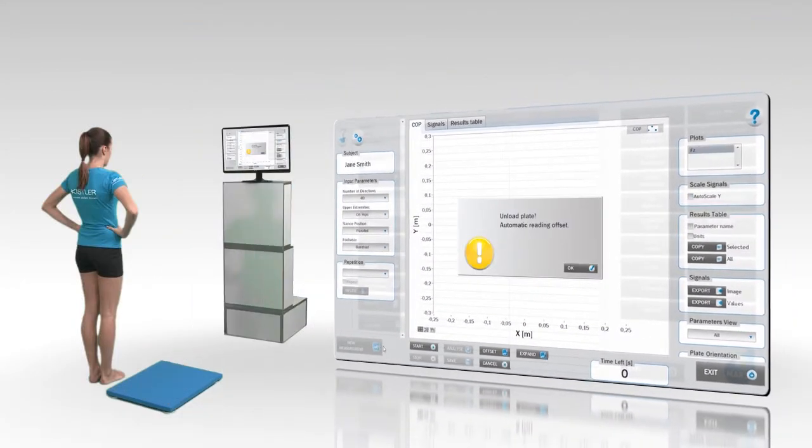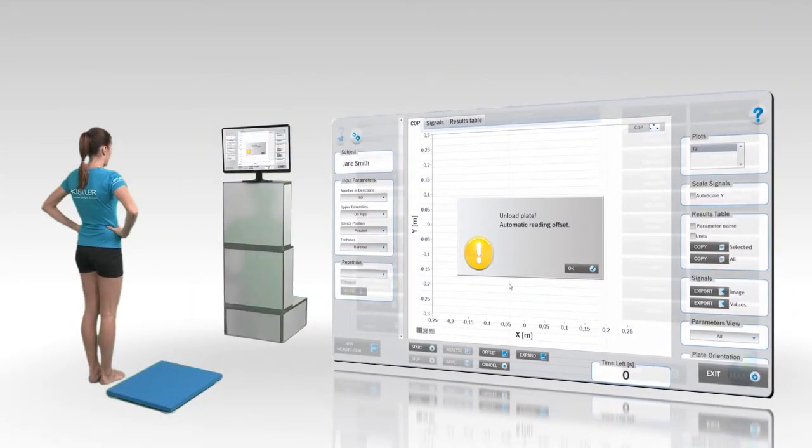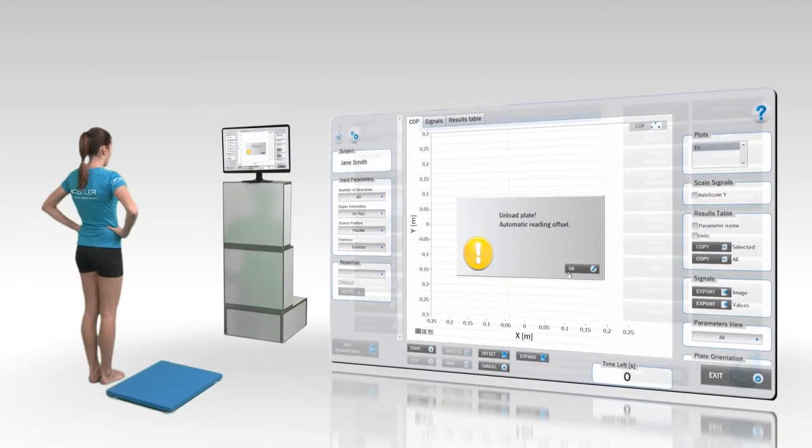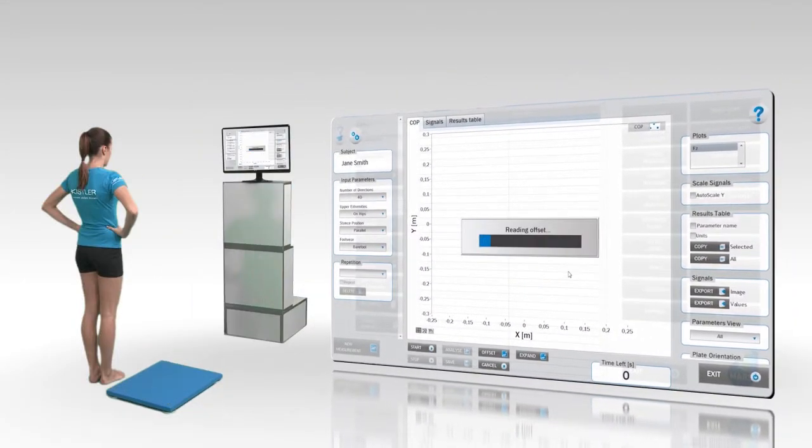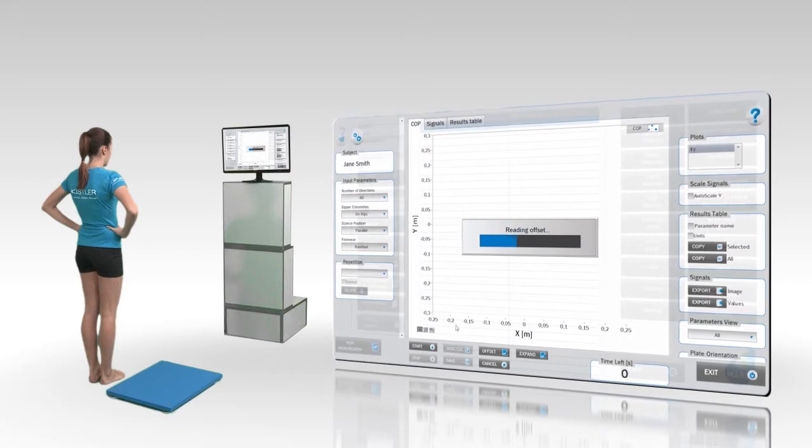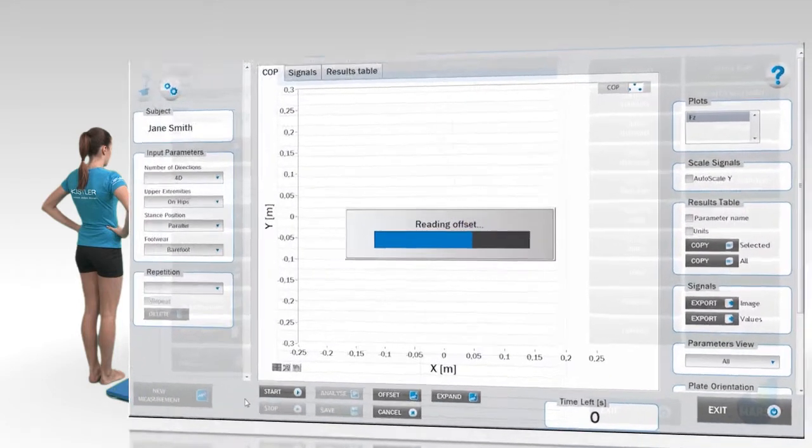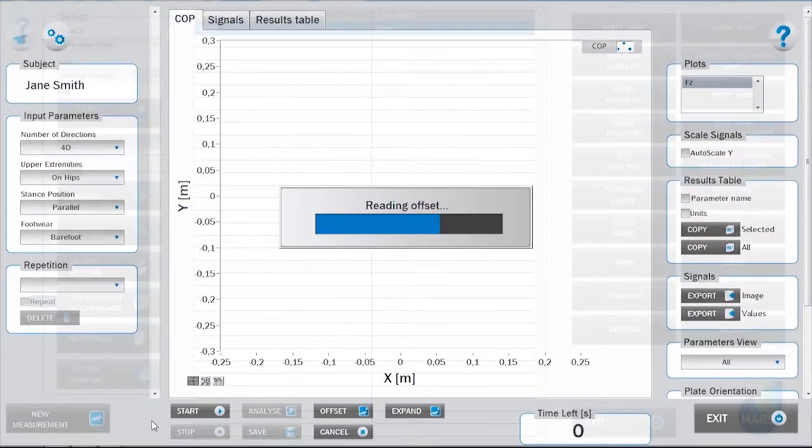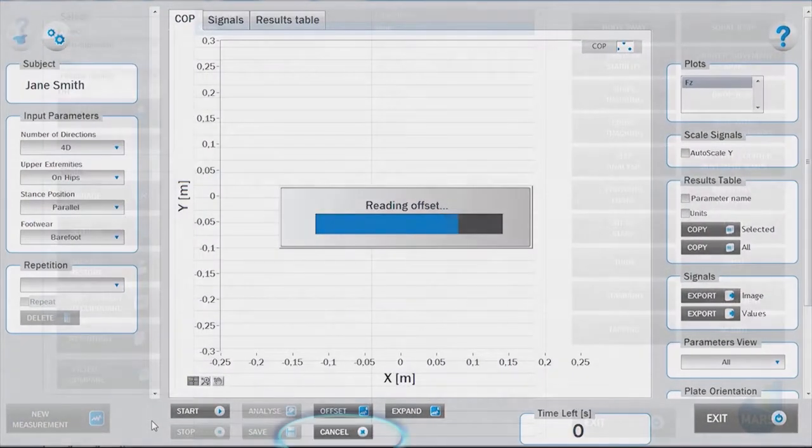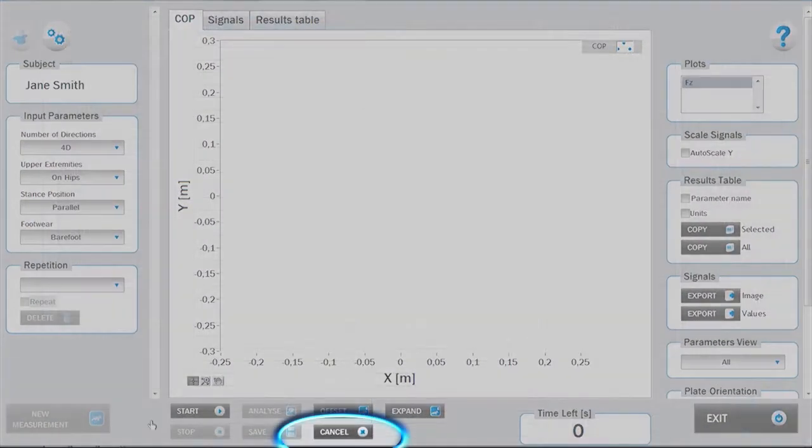During this time, the subject should not be on the force plate. If necessary, the measurement mode can be cancelled by pressing the Cancel button.